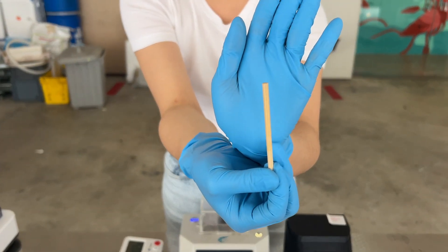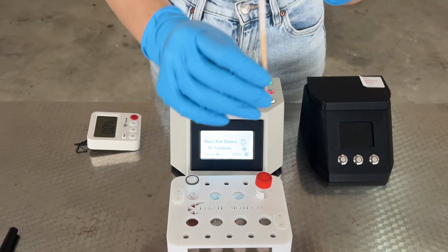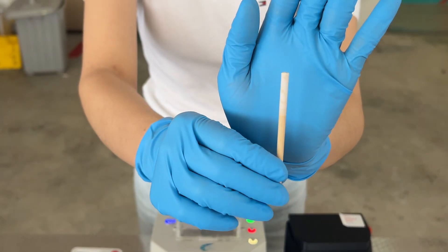Leave the stick to dry completely at ambient temperature. When it is dry, the coating on the tip of the stick will return to white. Ensure you don't touch the white coating. It is important to let the stick fully dry.